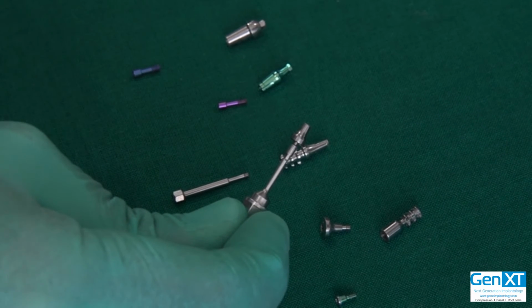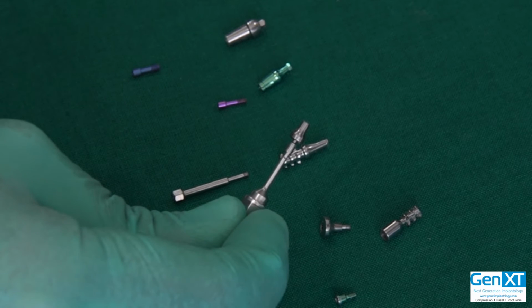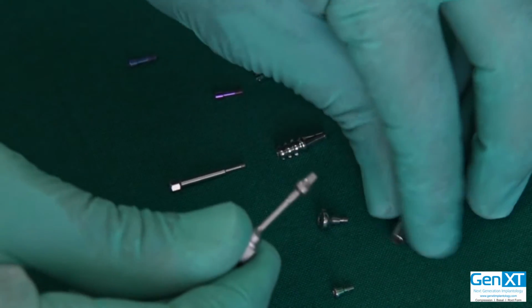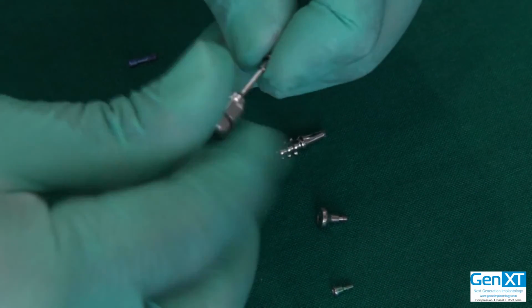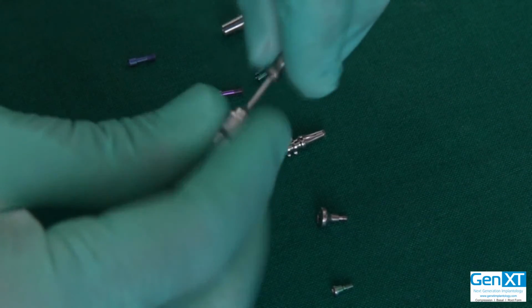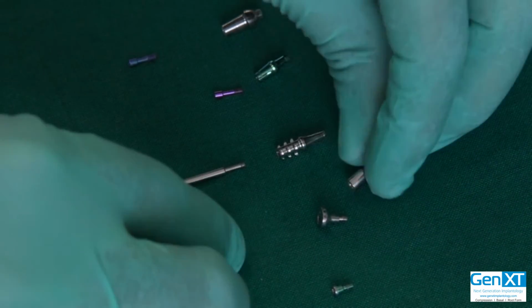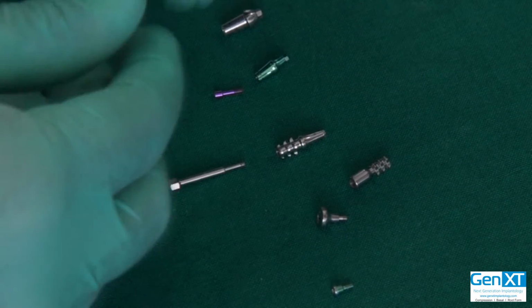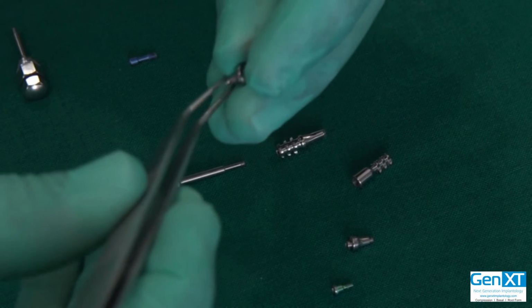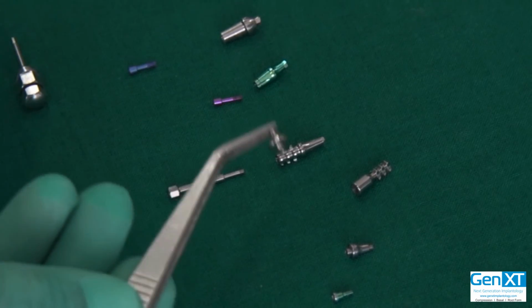Right. So you can add some composite, or some materials, to push the gingiva into the correct place with the gingiva former, and once it's in the correct place, you can just screw it in. We have gingiva formers in different sizes and lengths. This is the standard. Then you have the wide gingiva former.